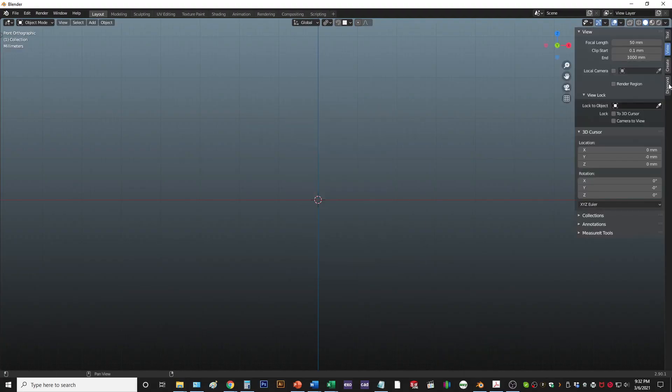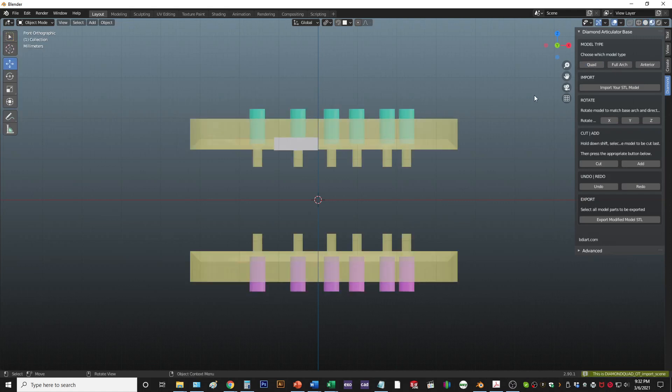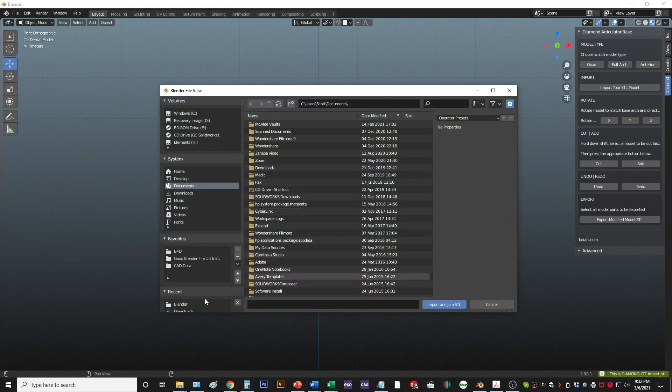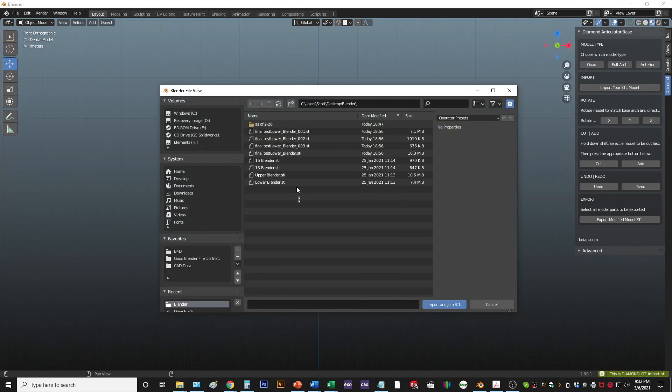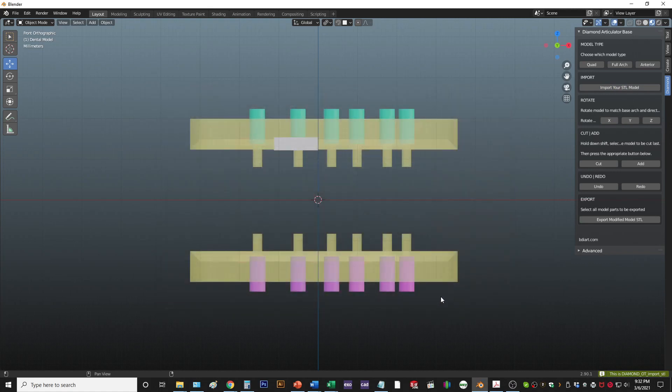You open up the window, click on the diamond, click the quad, and then import your files, STL files. This will pull it straight into the software.